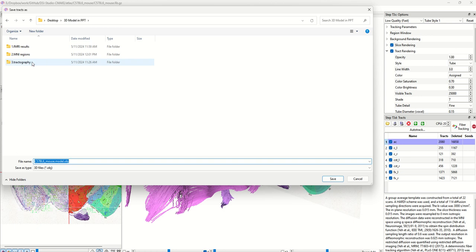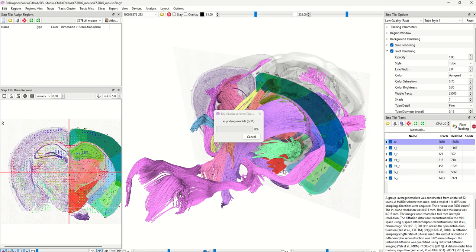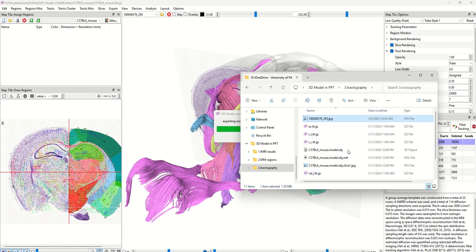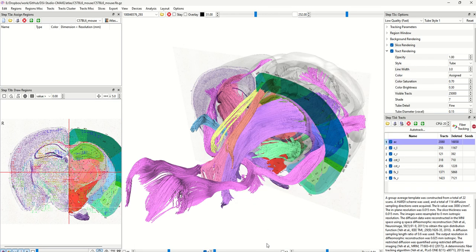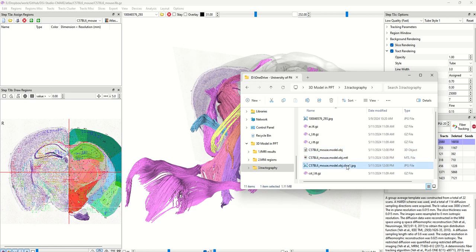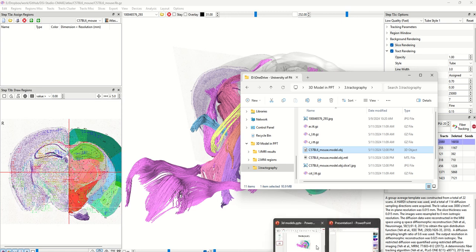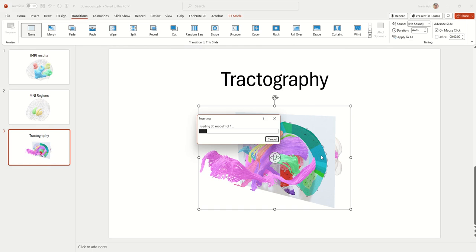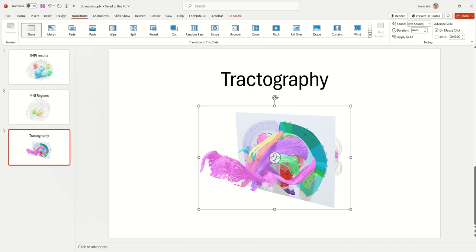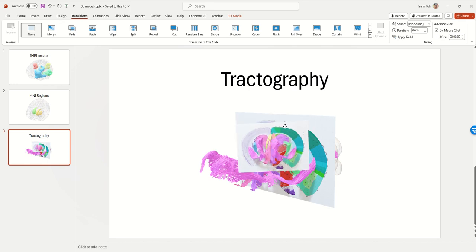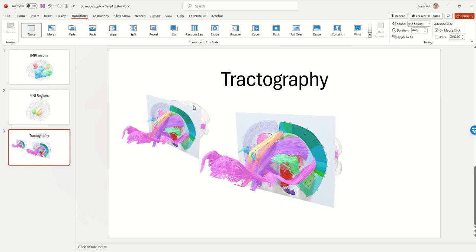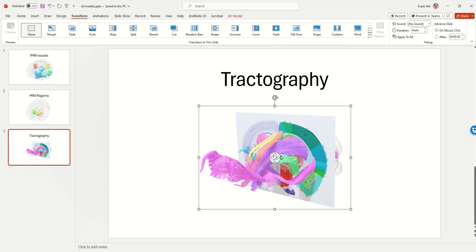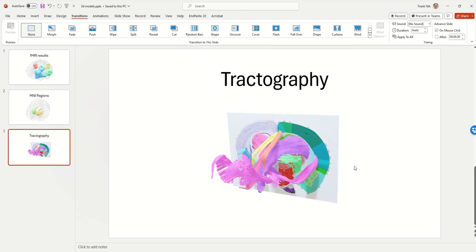Once everything is done, save the model and output it to a folder. You'll see a lot of 3D files output, including the OBJ file and material file; the slides will also be output as JPG. Drag the OBJ file into PowerPoint to visualize it. One limitation of PowerPoint 3D models is that they can only be rotated during editing mode — you can rotate to any location in editing mode, but this rotation is not available when you turn on the slideshow.